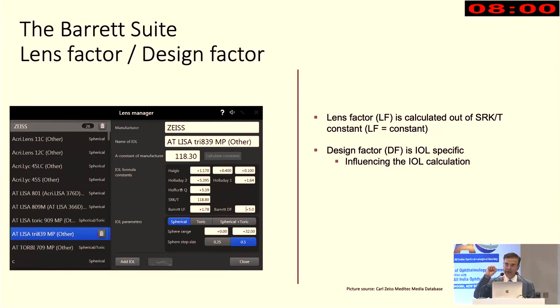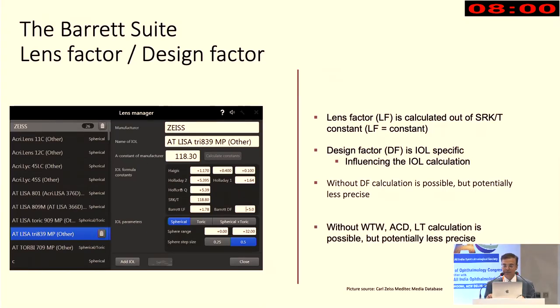In fact, it comes as very fine print under the place where you have the IOL power prediction using the particular formula. Please watch out for the design factor and the lens factor, whether it is fed in correctly for the particular lens you are using.